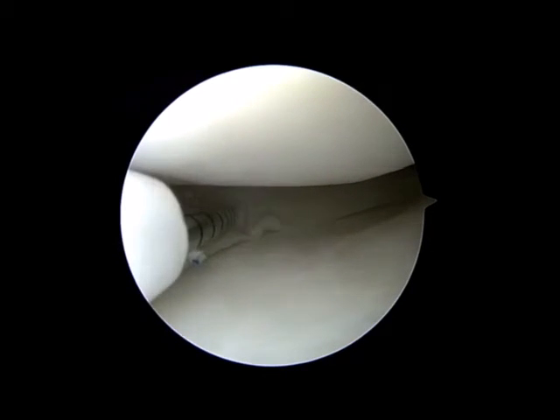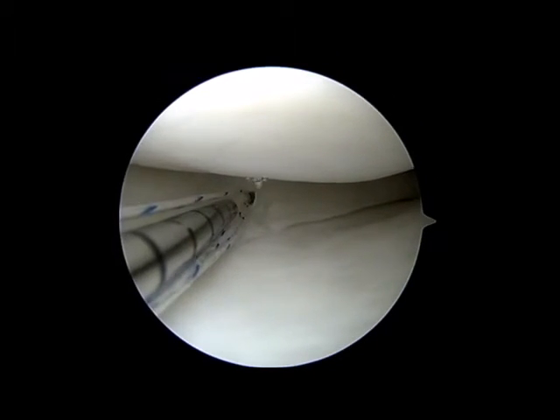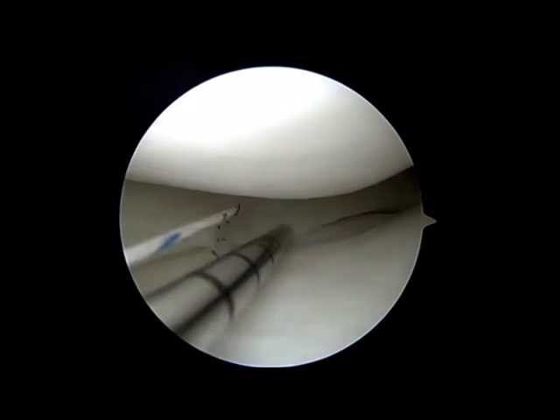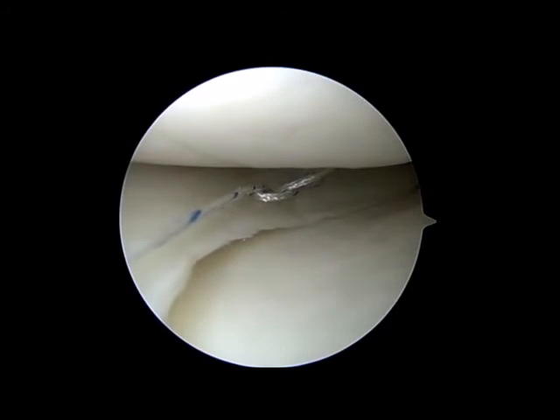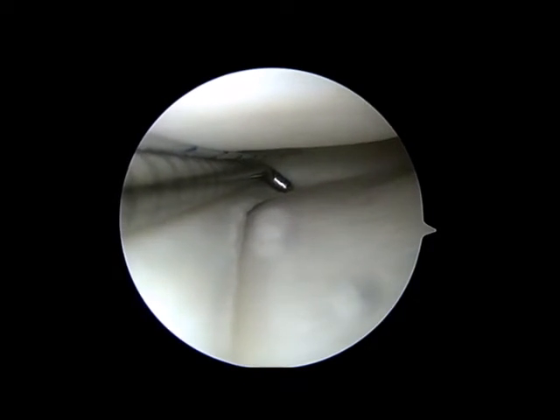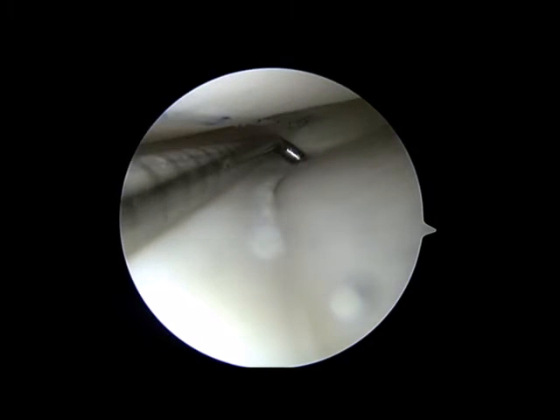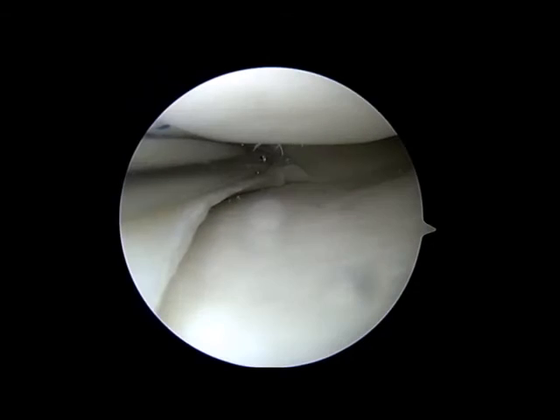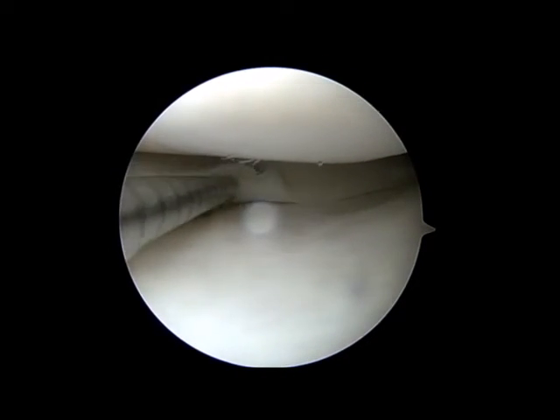The sutures are placed across the meniscus tear by using a specialized needle-like penetrating instrument. The penetrating device pushes the sutures through the meniscus tissue. The sutures are placed across the tear in two different spots, and then the knot is tightened. The knot is a self-locking sliding knot. You can see that it is being tensioned, and then a special cutter is brought in to cut the long end. Here you can see the cutter coming in. The knot is trimmed, and then I bring in a probe to check the knot and check the first suture.